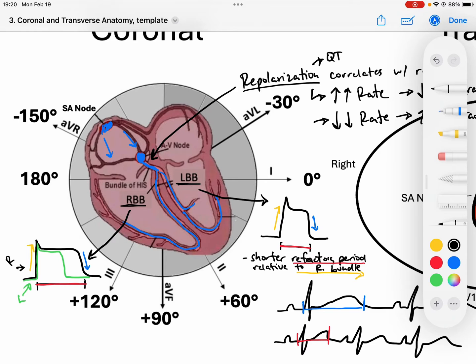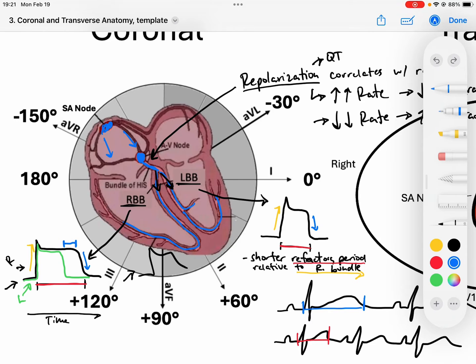Here's where something really interesting happens. Normally, the next beat comes down and signals these bundle branches to send the signal, they recover, and then the next beat occurs right on time — we get depolarization again. But what happens if, during this moment in time — right here — I get a premature atrial contraction? Notice that at this point, my left bundle branch has already recovered and repolarized, but my right bundle branch hasn't — it's still not yet repolarized or recovered. So what if a PAC occurs right there?